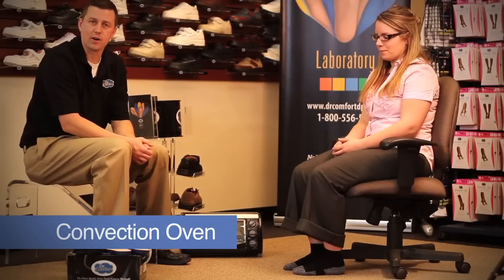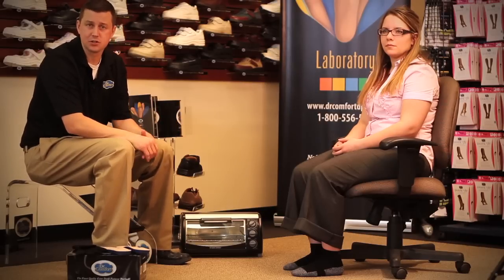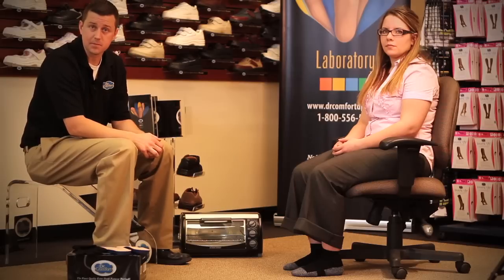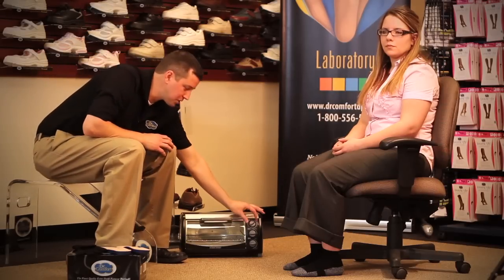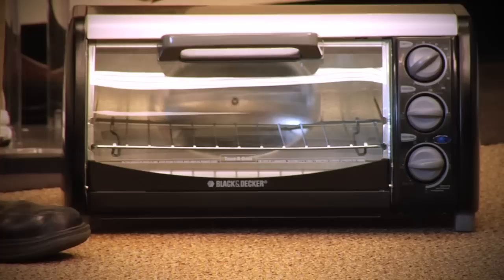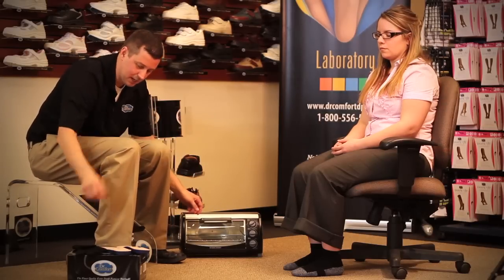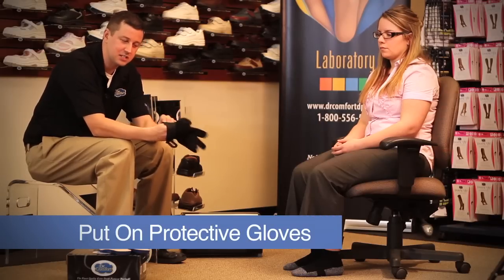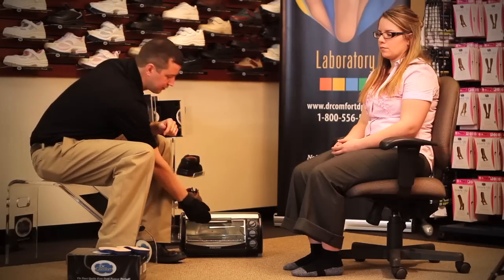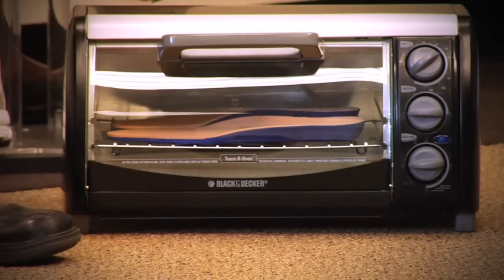For the next demonstration we will use the convection oven to heat mold the inserts. As you can see, Mallory is wearing socks, which is advised for diabetic patients — when heat molding these inserts, patients should wear socks, not go barefoot or wear nylons, because that could burn the patient. This applies for both the convection oven and the heat gun. To begin, verify the fit for the patient, then set the convection oven to above 230 degrees Fahrenheit. Set a timer to ensure the appropriate amount of time so you're not burning the inserts — you may want to practice that ahead of time. Once the appropriate temperature is achieved, put on protective gloves before placing the inserts in, and you can place both inserts in at one time.